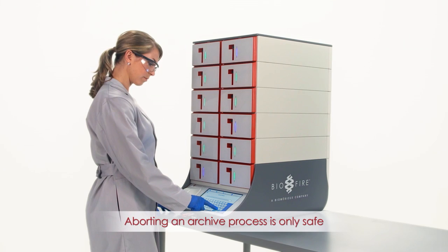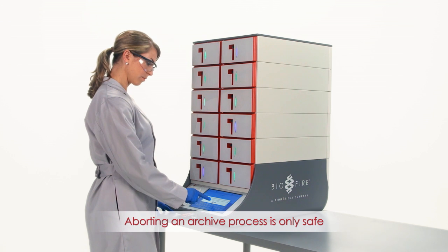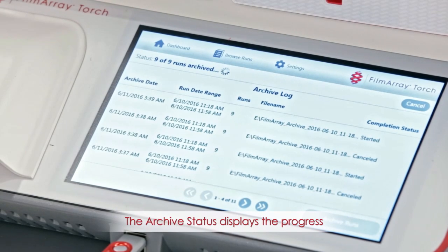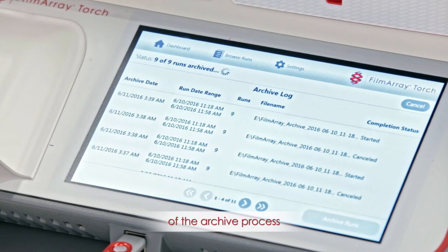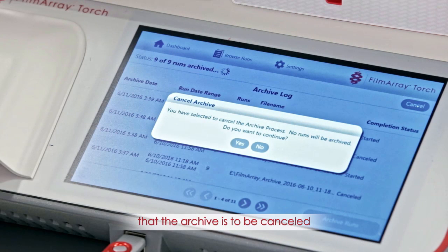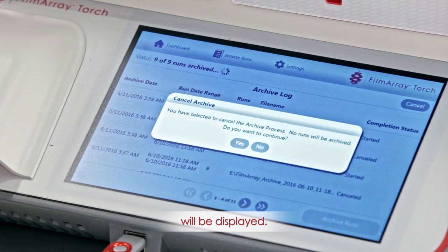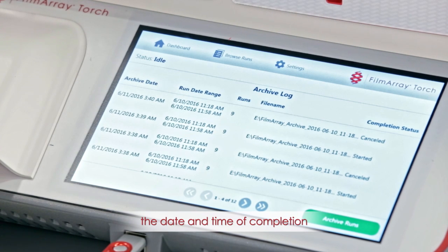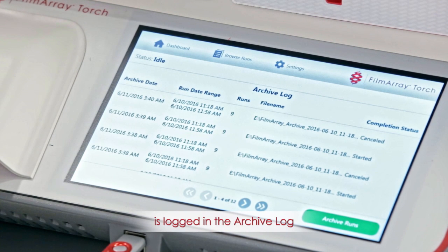Abort Archive Process. Aborting an archive process is only safe while the runs are being saved. The archive status displays the progress of the archive process with an option to cancel. Select Cancel and a confirmation that the archive is to be canceled will be displayed. When cancellation is complete, the date and time of completion is logged in the archive log, and the archiving status will appear as idle.